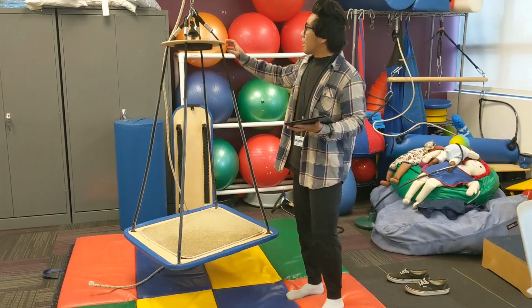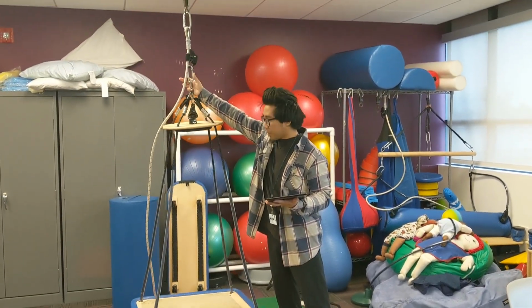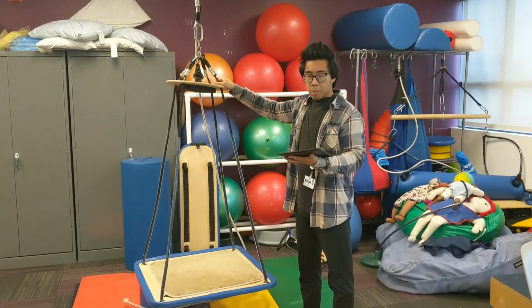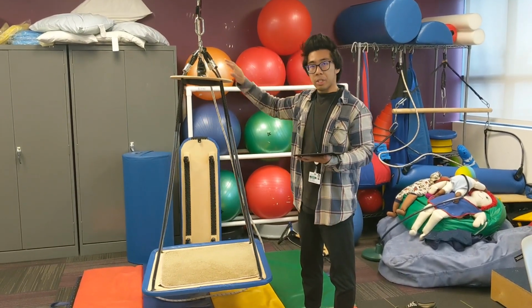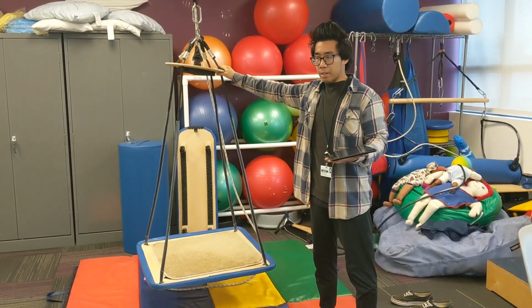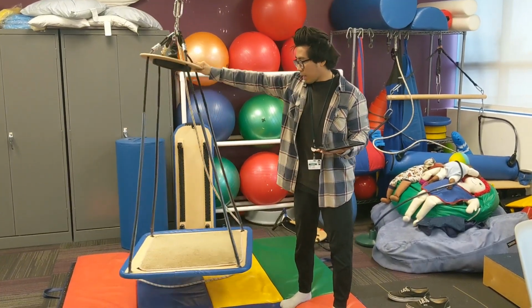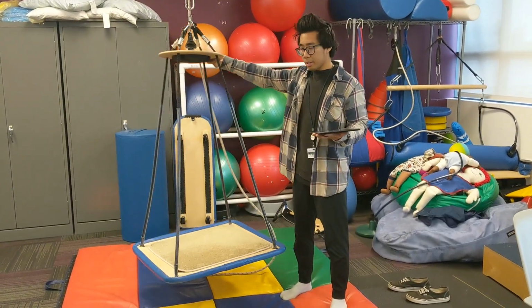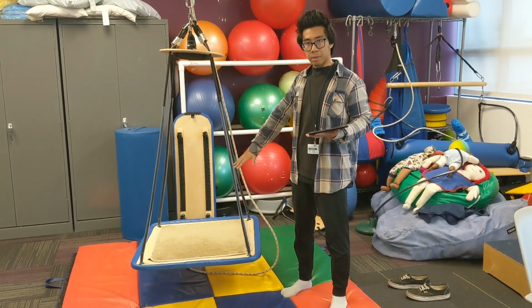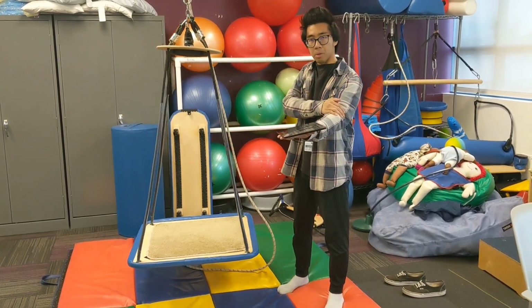This is the platform swing. I set up suspensions correctly by using proper body mechanics with the notches facing up. The purpose of the swing, or swings in general, is to provide proprioceptive input, vestibular input, and tactile input. So vestibular input as they sway front to back, side to side, and rotary movements. Proprioceptive input as the child is able to push down onto the surfaces of the swing. And tactile input as they feel the surfaces on their skin.